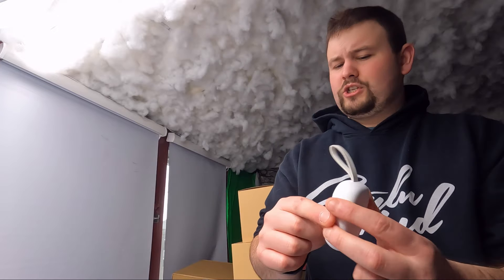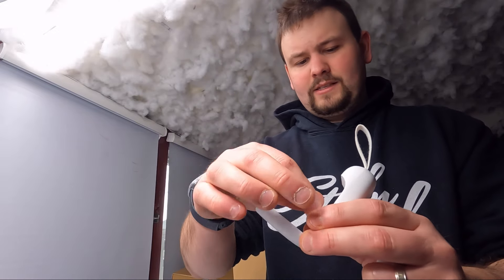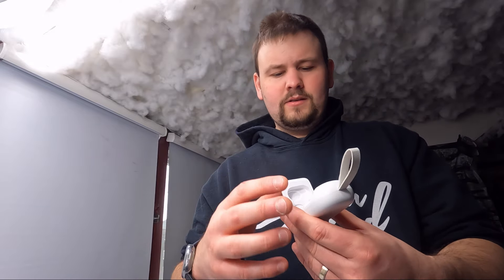When you press and hold to turn it on there's no sound, but a green light shows up, and if you put it near your ear you can hear that it's on. When you press and hold to turn it off, it makes a sound to let you know it's off. To charge them, simply place them back in the case and they start automatically charging — just like that.